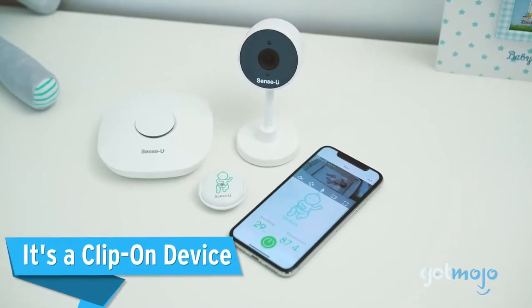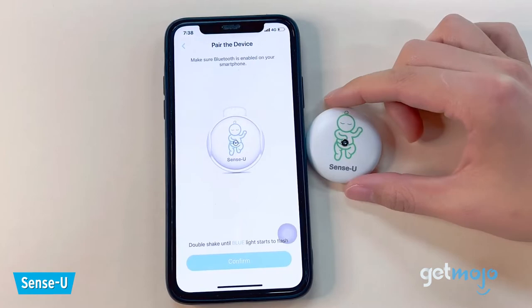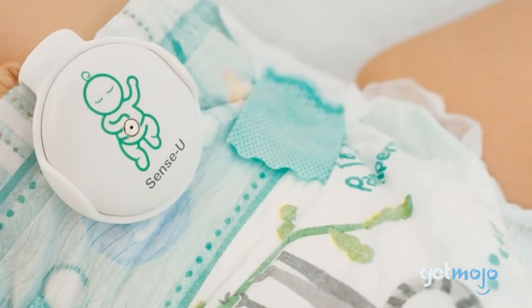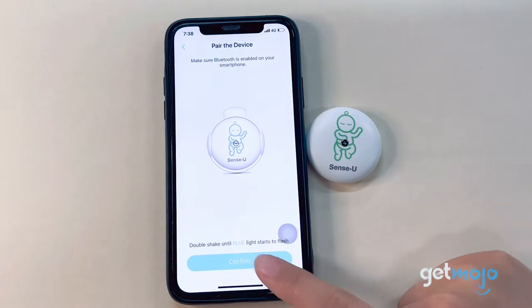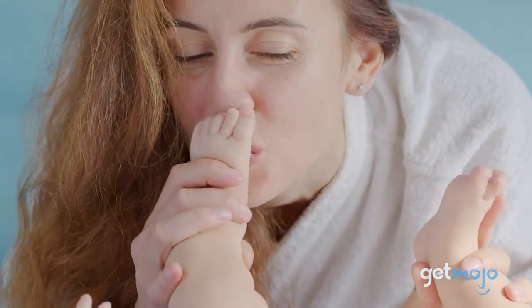It's a clip-on device. The Sensu's Sense Clip is an app-enabled wearable that snugly fits onto a baby's diaper or sleepwear close to the belly button. It's integrated with a high-performance sensor chipset which tracks a baby's abdominal movement. The device easily attaches as a clip-on or button to provide vital information about babies as they sleep. It's tiny and portable, just like your little one.